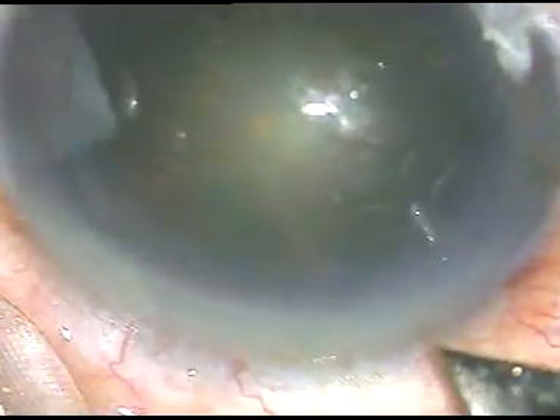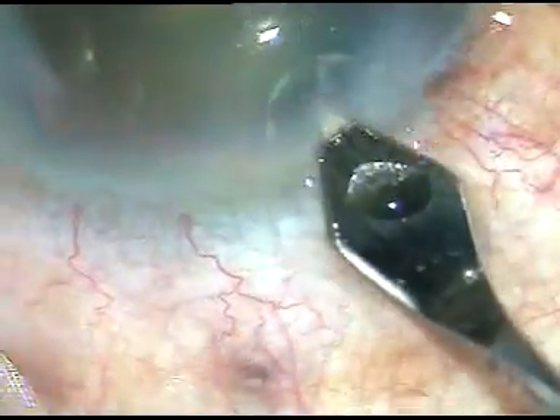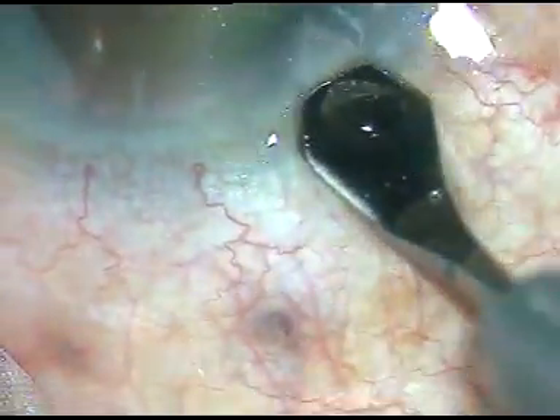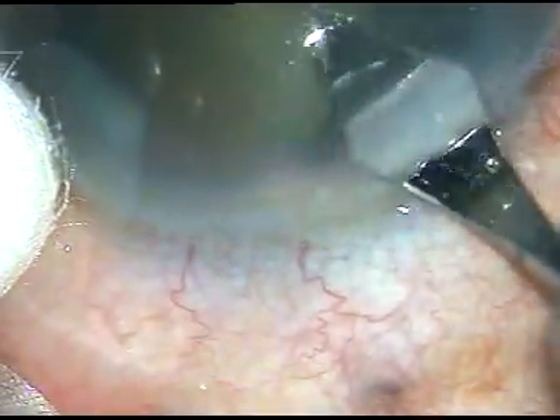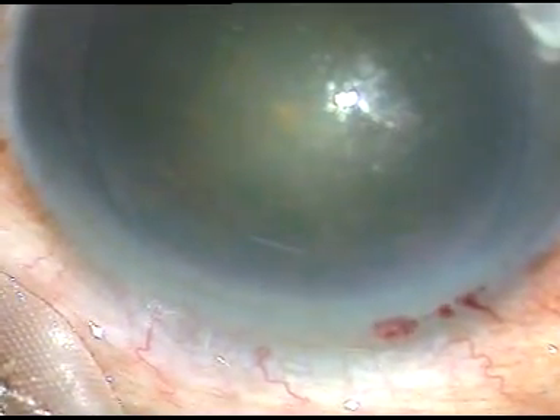Friends, this is an unedited surgery. This is phacoemulsification of a cataract with grade 2 plus nuclear sclerosis. You can see this is the main incision. This is a posteriorly placed incision and you can see that blood is oozing out of the capillaries.